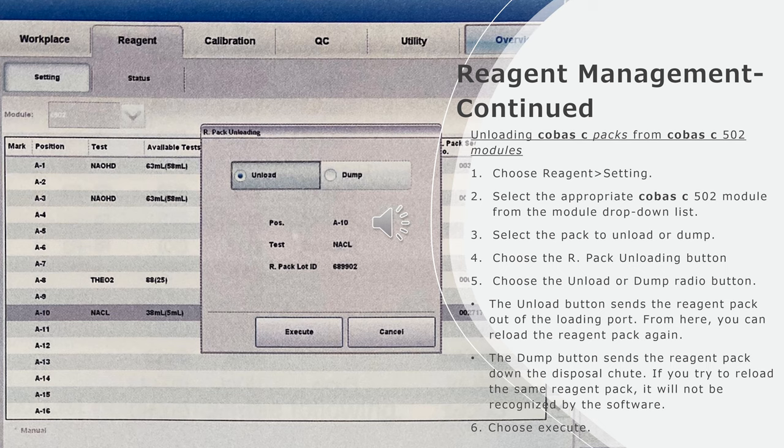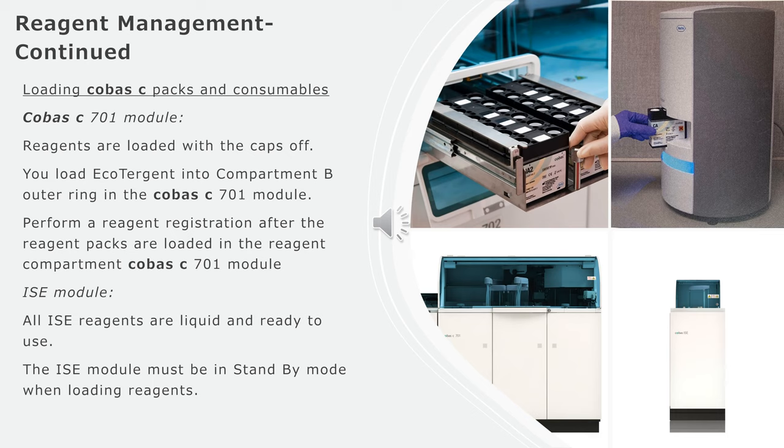The unload button sends the reagent pack out of the loading port, from here you can reload the reagent pack again. The dump button sends the reagent pack down the disposal chute. If you try to reload the same reagent pack, it will not be recognized by the software. Choose execute.